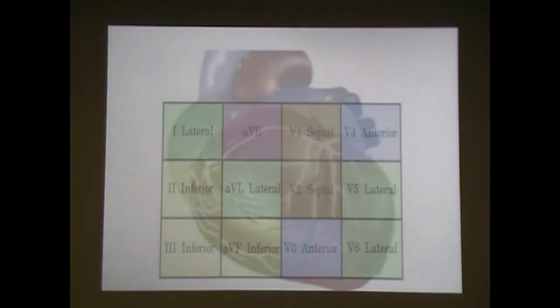So anytime you get a new medic or you're trying to teach someone, have them hold up an EKG to their chest and think about it. I think this really helps them understand where things are going on. Because if I've got a septal, hey, look, septal's right in the middle. Even though I find the septal thing kind of a joke, and I'll talk about that in a minute.